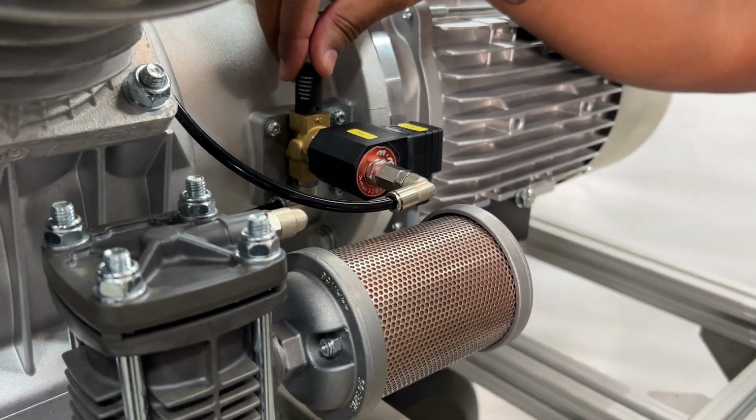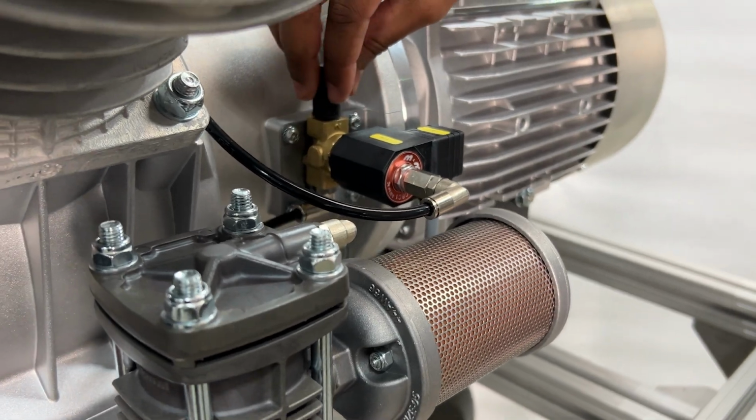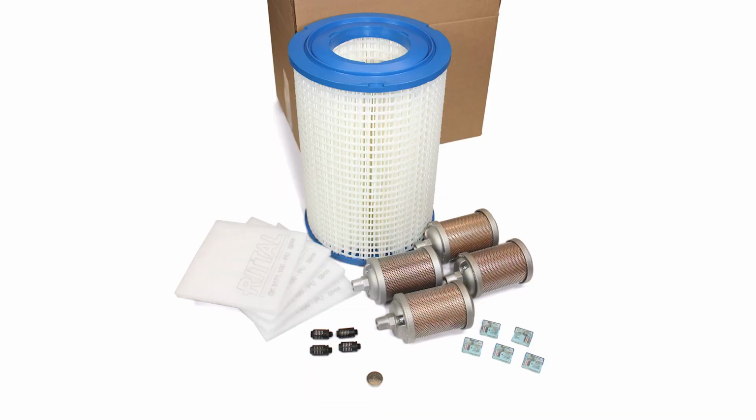Carefully unscrew and remove the existing muffler intake from each aggregate. Retrieve a new muffler intake from your maintenance kit, ensuring it matches the specifications of the one you just removed.